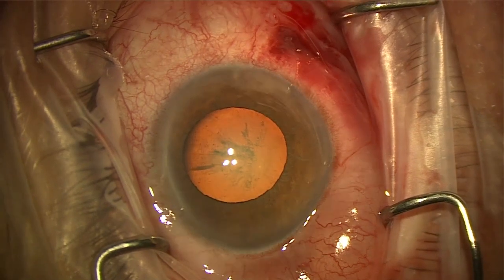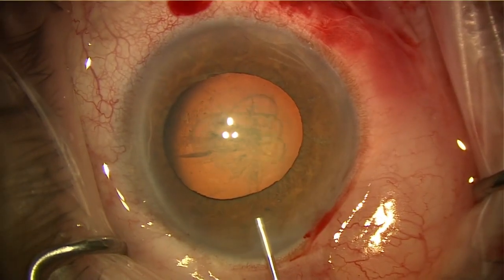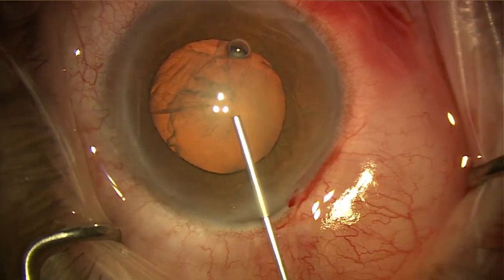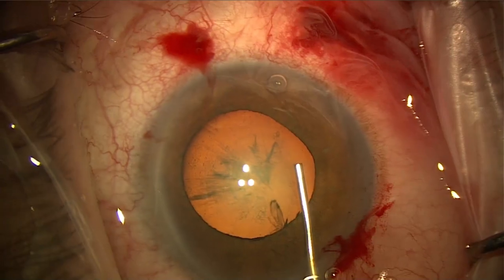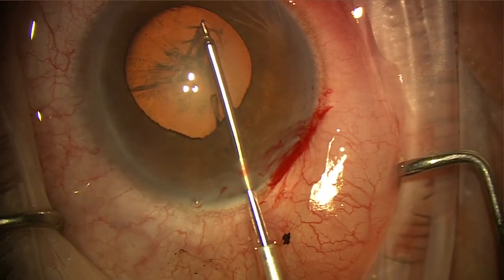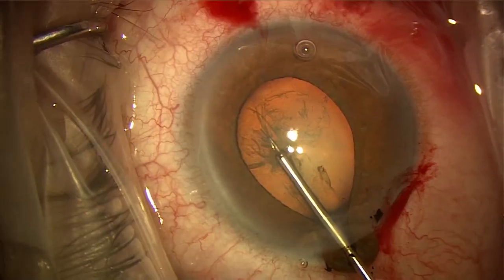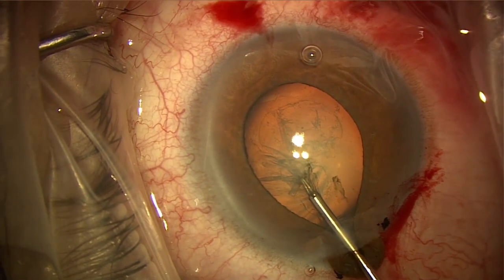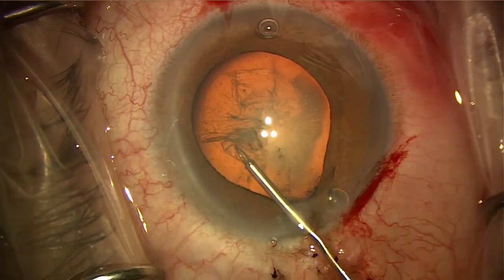This second case is quite a complex case of a subluxed lens in the context of previous angle closure. The patient has a pressure of 35. It's still on 3 classes of medication with a relatively open angle. We're carrying out a capsulorhexis here, and you can see that the zonules are significantly weakened because of the previous angle closure attack.